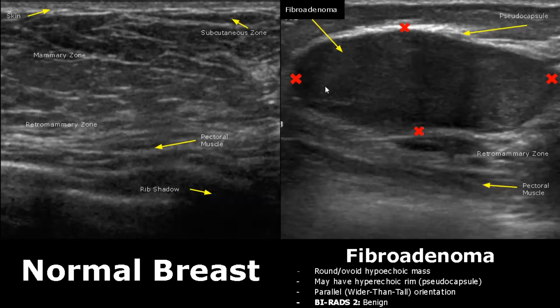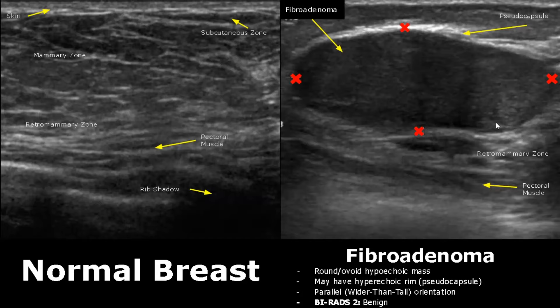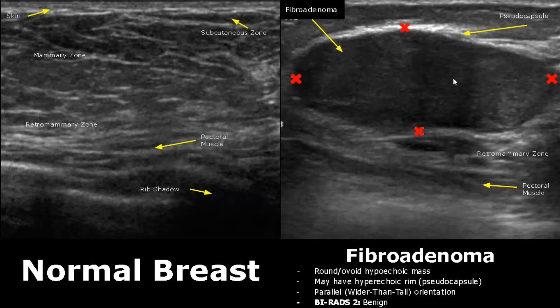A fibroadenoma is a benign tumor which will appear as a hypoechoic, round or ovoid mass. It may have a hyperechoic rim known as a pseudo-capsule, and it has a parallel orientation — it is wider than tall. This is a sign of a benign lesion. It is classified as BI-RADS 2, though routine screening mammography should still be done.